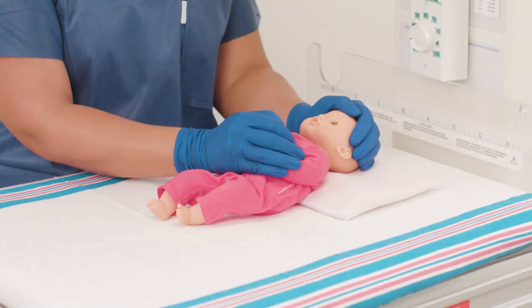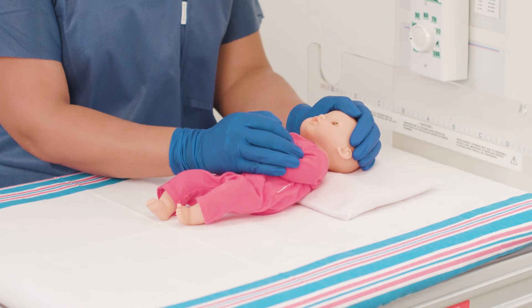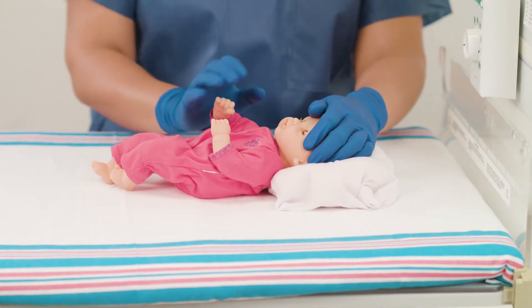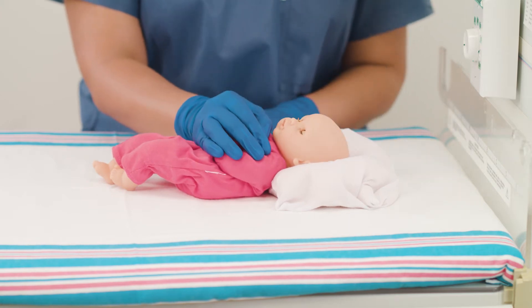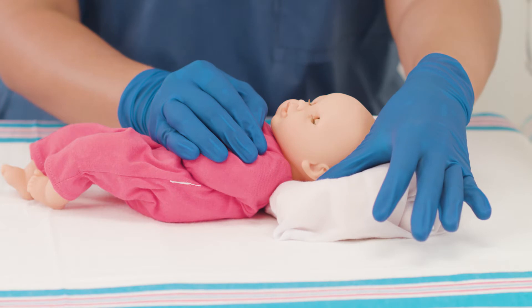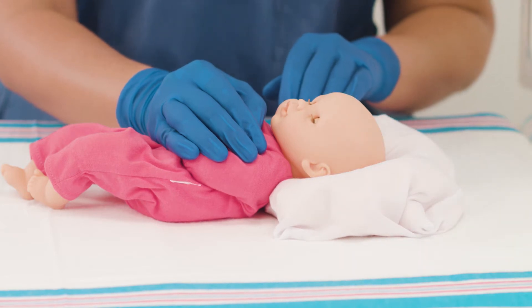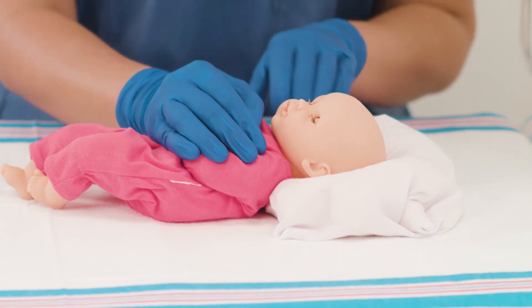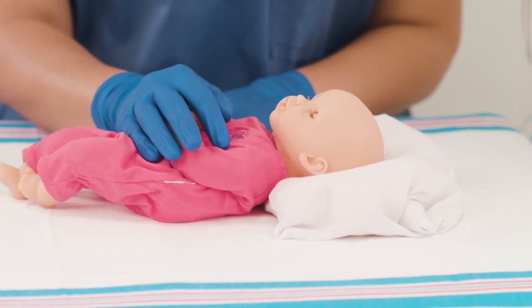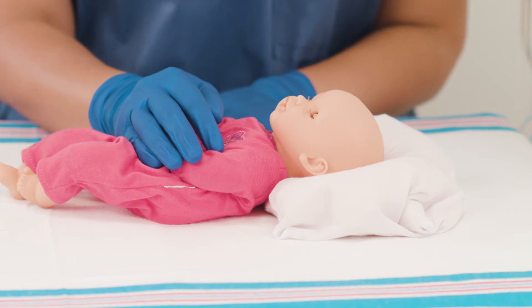The Molnica Ziflow fluidized positioner facilitates developmental positioning for infants while helping reduction of pressure ulcers by offloading of bony prominences. This video demonstrates the use of small positioners to position a baby's head. Head positioning for preemies as well as full-term babies are addressed by the small fluidized positioner, which offers symmetrical support for the still developing skull.